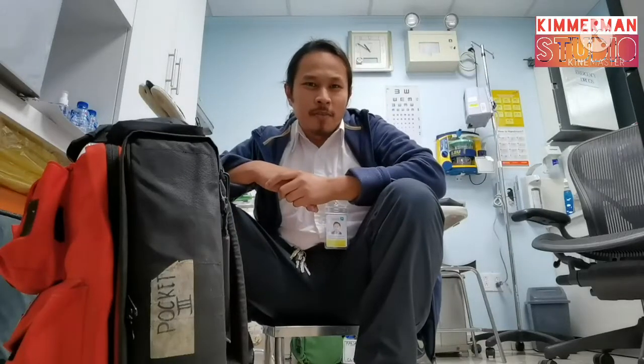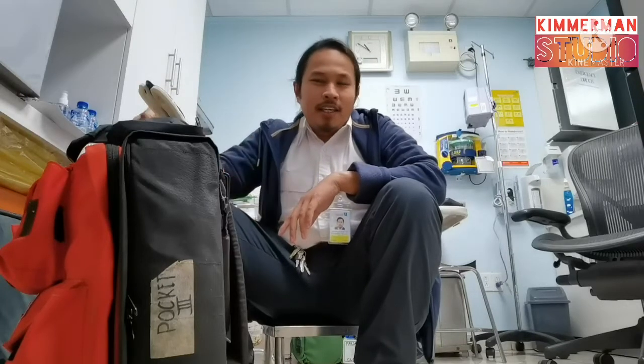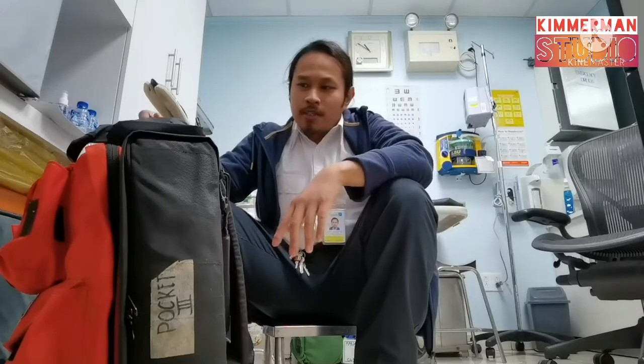Good day guys, this is Kimmerman from Kimmerman Studio. Today we will check one of the important equipment of a medic: the ER bag or the Emergency Response Bag.